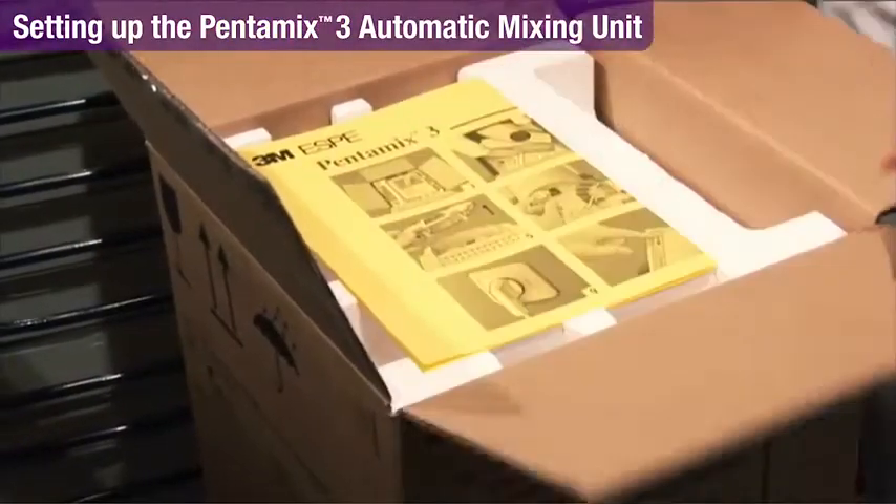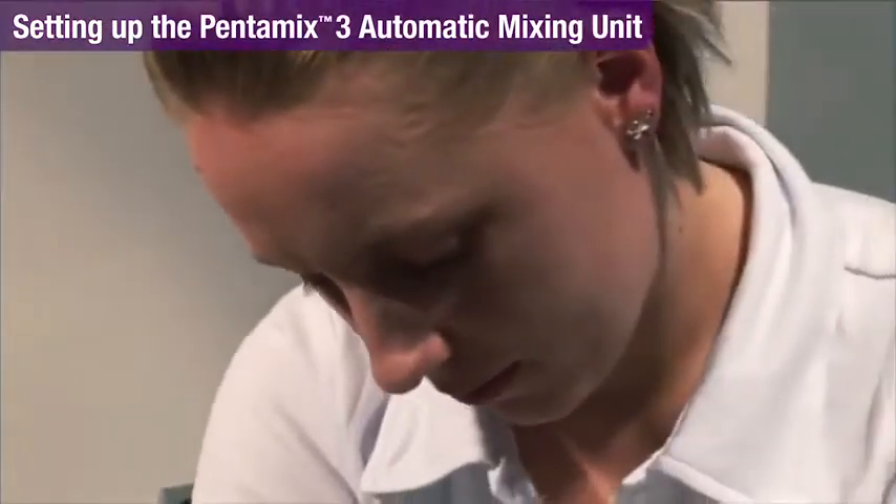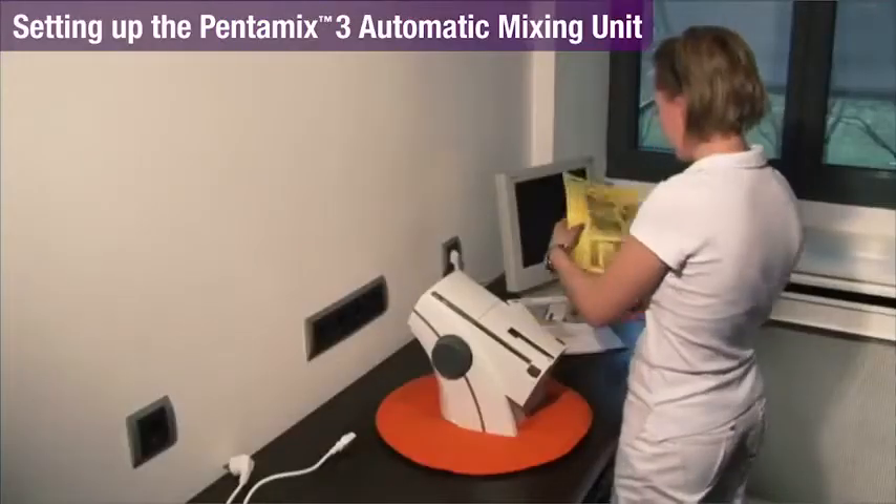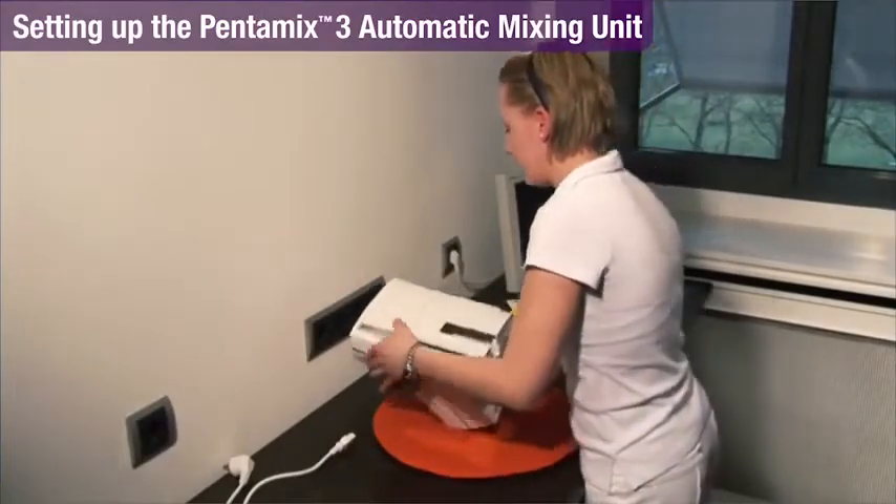Let's look at how easy it is to set up and use the PentaMix 3 Automatic Mixing Unit. Place the unit on a flat, sturdy surface out of direct sunlight, or see instructions for wall mounting.